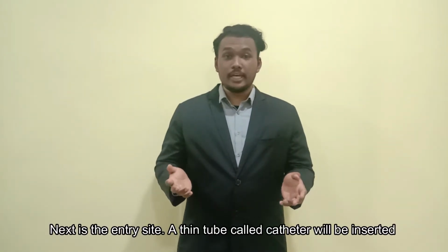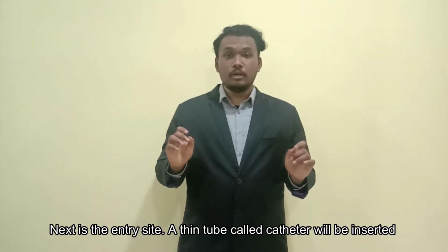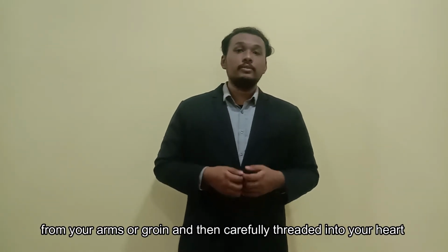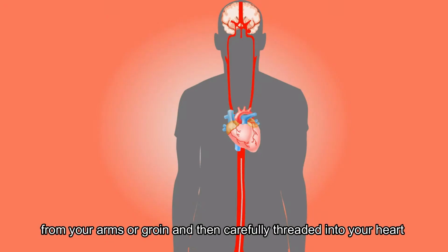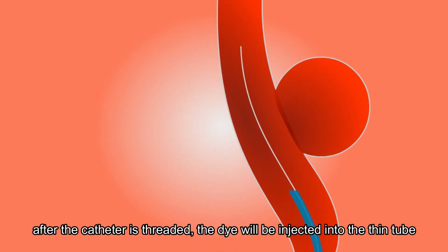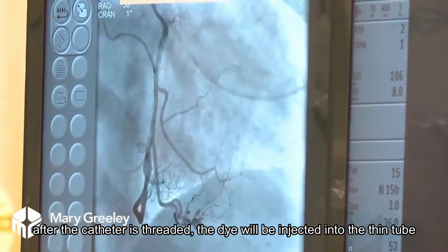Next is the entry site. A small thin tube called a catheter will be inserted from your arm or your groin and then carefully threaded into your heart. After the catheter is threaded to your heart, the dye, which is visible to the X-ray, will be injected through the thin tube.